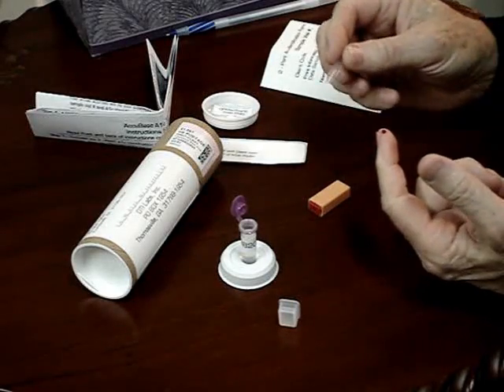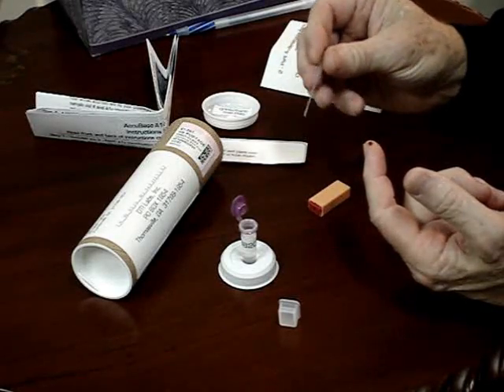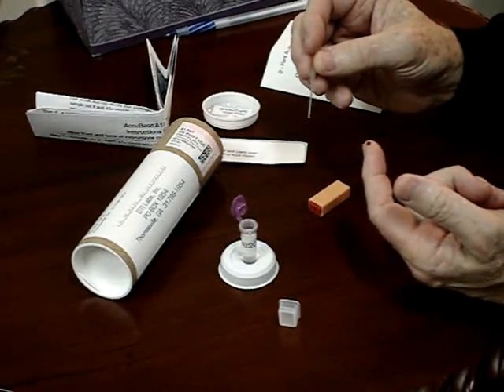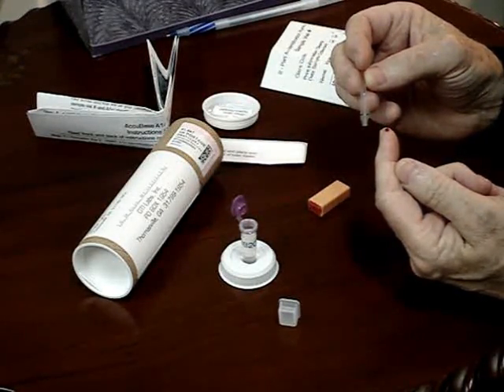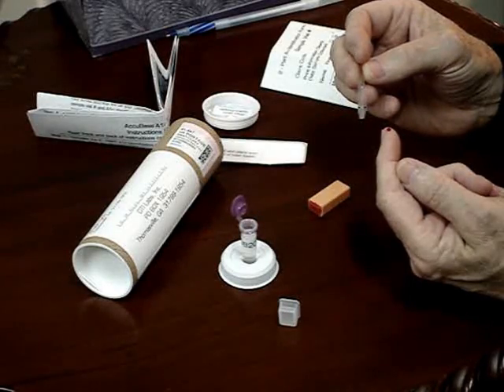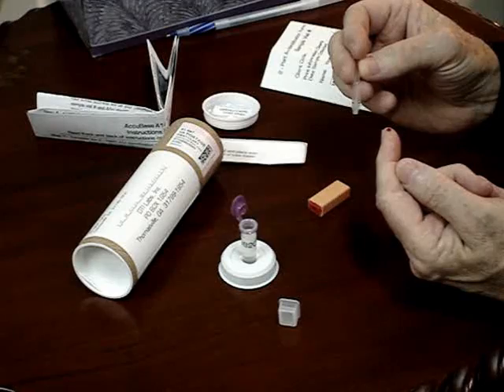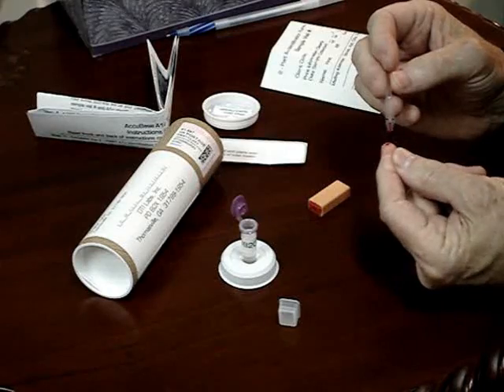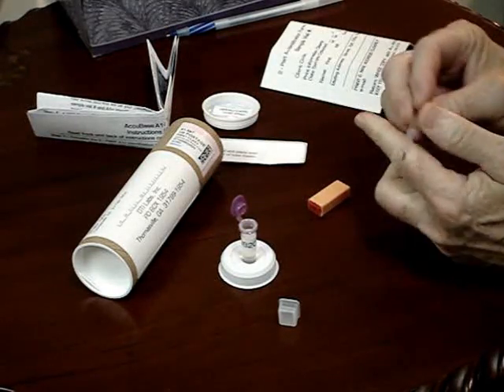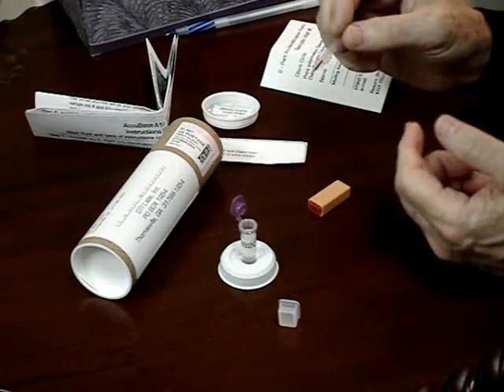Next, pick up the capillary tube device and position it in the drop of blood. Do not squeeze the bulb of the device during this step. Simply hold the device in order to allow the tube to fill automatically to the 2 black lines. This is completed by capillary action. You do not need more blood to complete this test. Put a little bit more blood so that it fills to the 2 black lines.